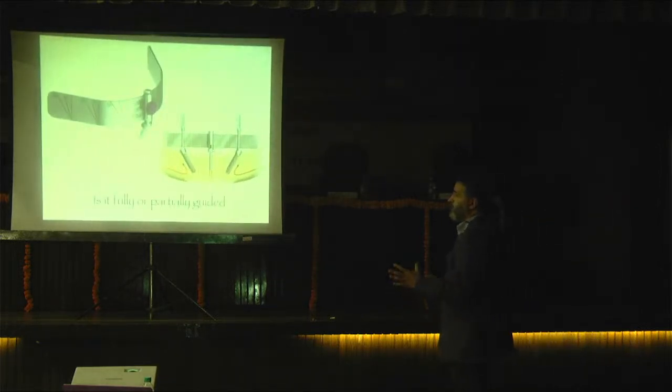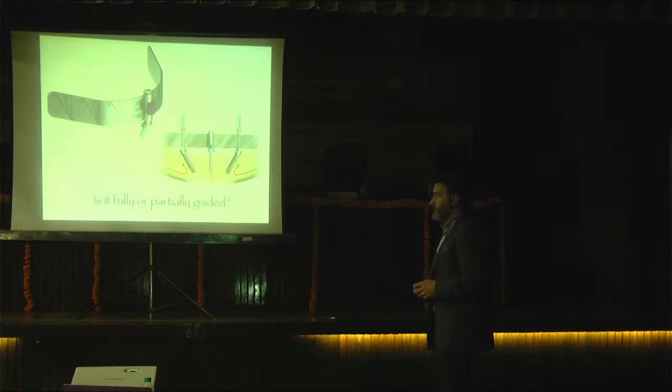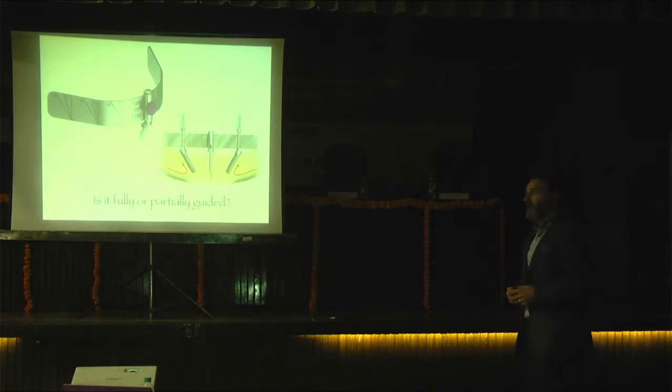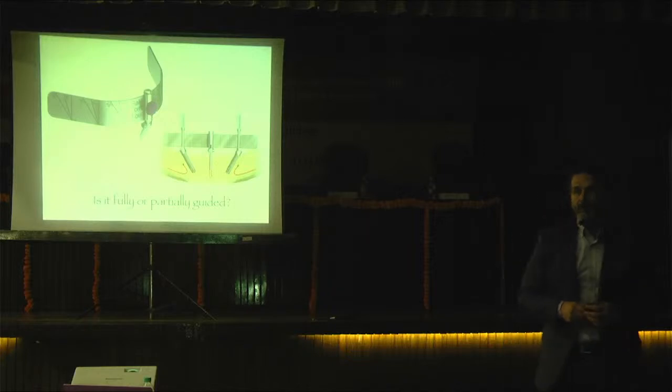And maybe you have heard about all-on-4 systems, all-on-6 systems. We place so many implants, tilted implants. Yes, we may have some complementary apparatus, but let me ask you a question. Is it fully or partially guided? Yes, guided, but not an entirely guided procedure, because when you move, you may have the chance to fail. But in the M-Guide system, if you try to do the wrong thing, the system doesn't help you with that.